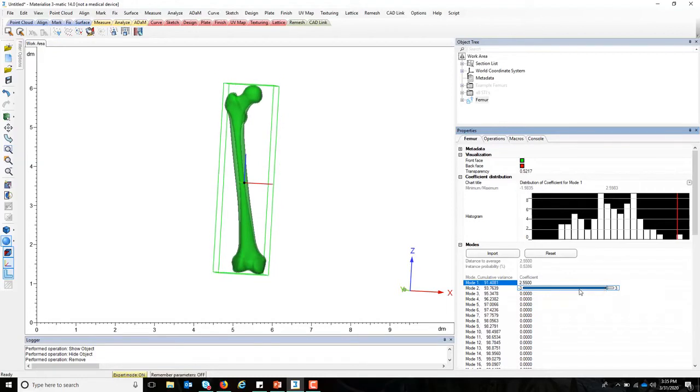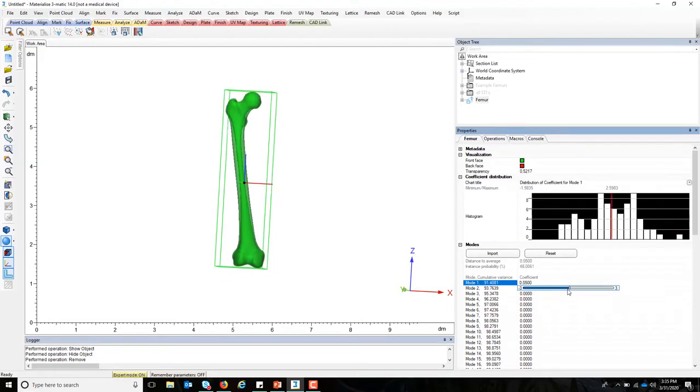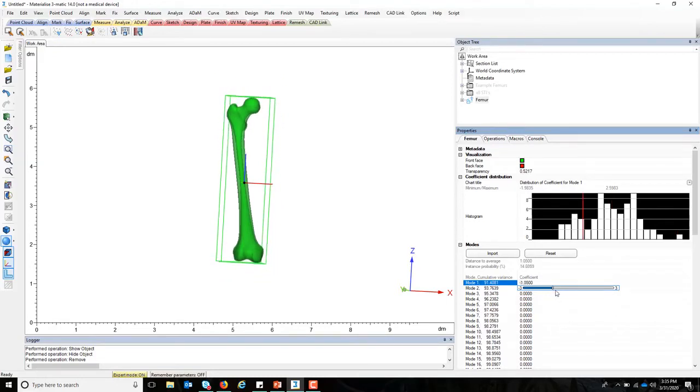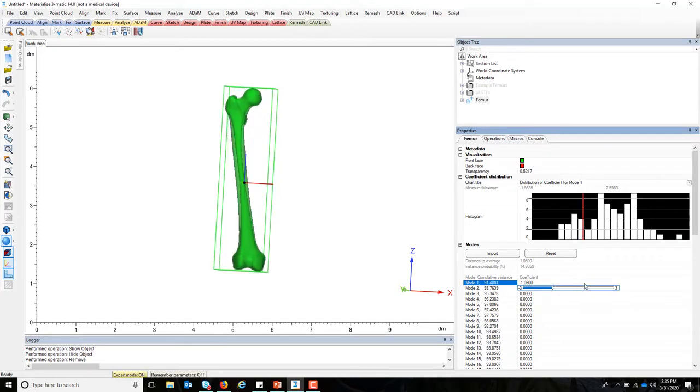And what you see in mode 1 is that, for the most part, it seems to me that just the general size is scaling.